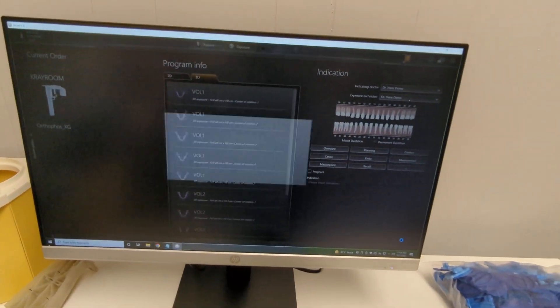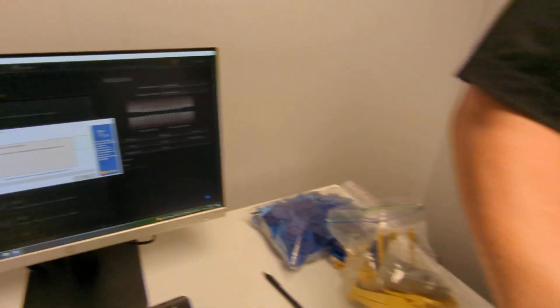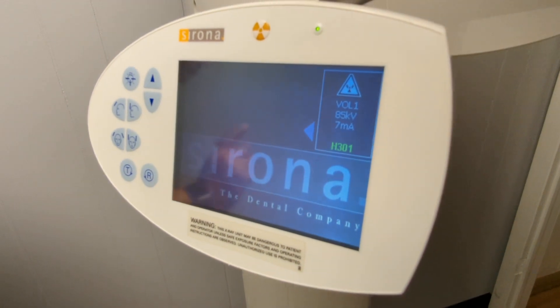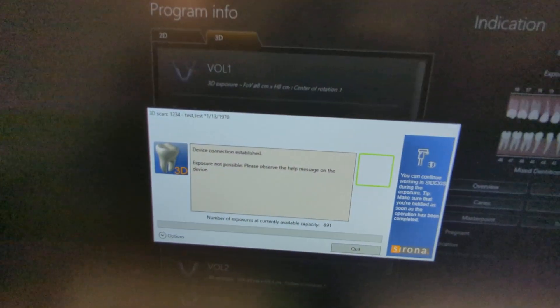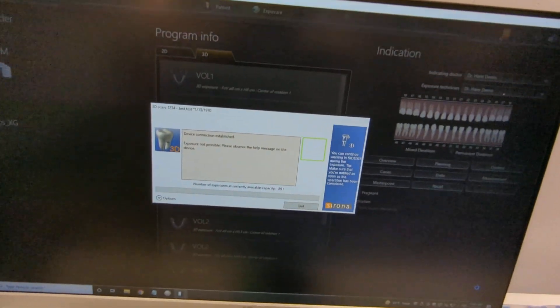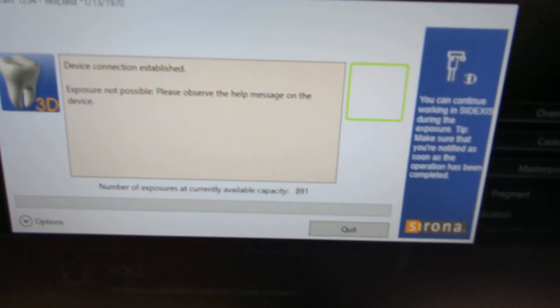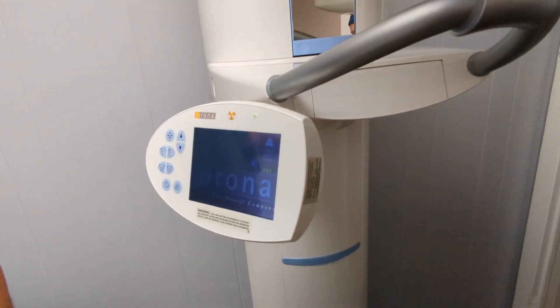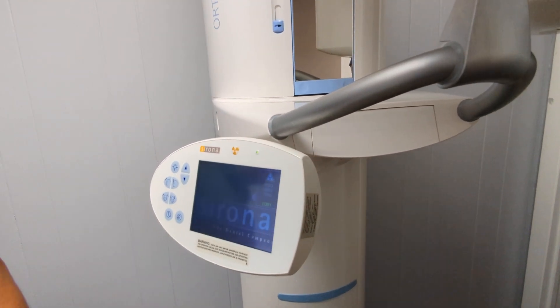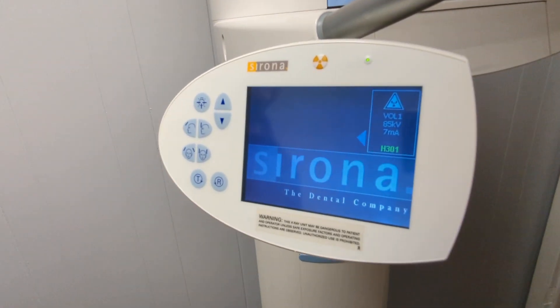Now you'll notice the unit is ready to roll. But don't hit that Next button until you have the patient in here ready to go — sorry, I went too quick there. It kind of locks in. Get your patient in here first, because if you hit that button already you can't go up or down or adjust. Once you are ready, then hit that Next button.